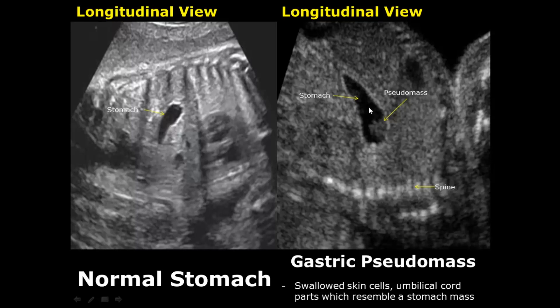Over here we have the gastric pseudomass seen in longitudinal view, due to swallowed materials such as skin cells, blood, or parts of the umbilical cord. And here is the fetal spine.